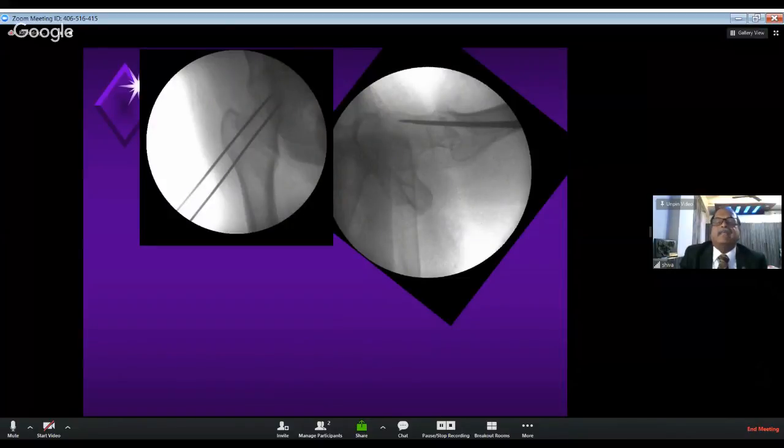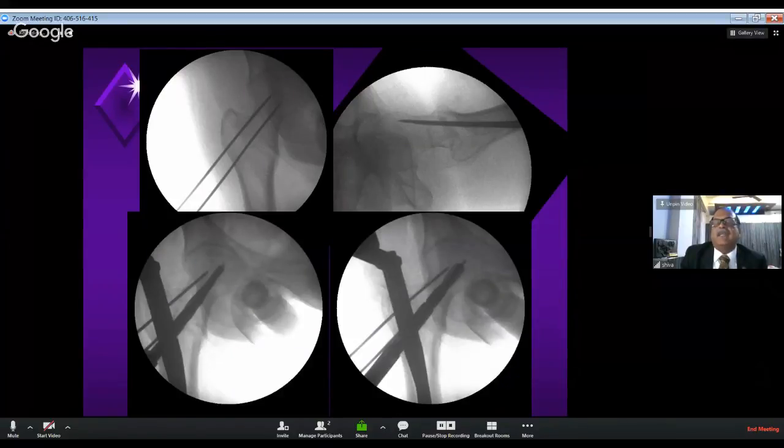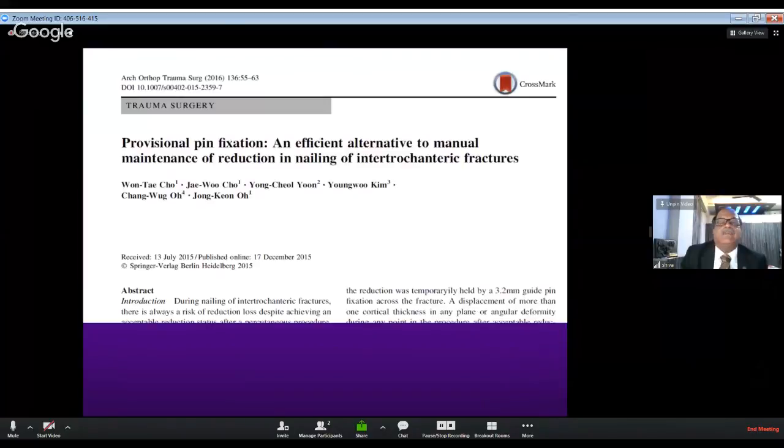Even a crack fracture, I try to fix with K-wires. The reason is, for a crack fracture like this, if I insert the 15 or 16 millimeter reamer, the fracture gets opened up superiorly. It widens the proximal fragment, and that will cause lateralization of the shaft, and the patient will not have a proper gait even if the fracture unites correctly. So to avoid that, even crack fractures, I always fix with 2 K-wires before I do any further procedure on them. Here I have used a PFN and I have fixed the fracture in this fashion.